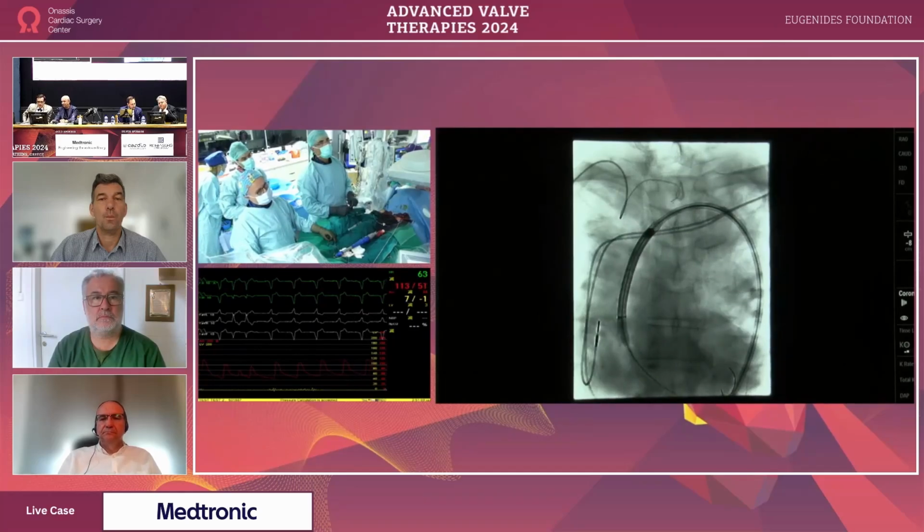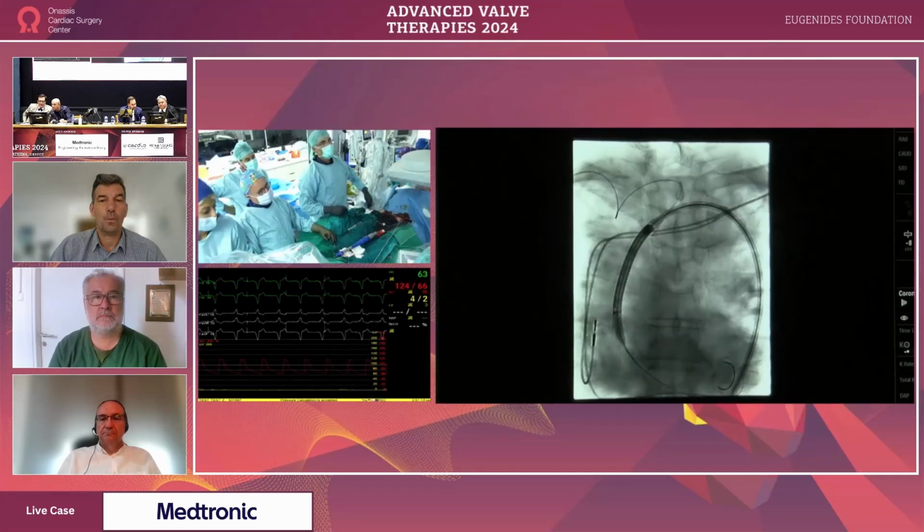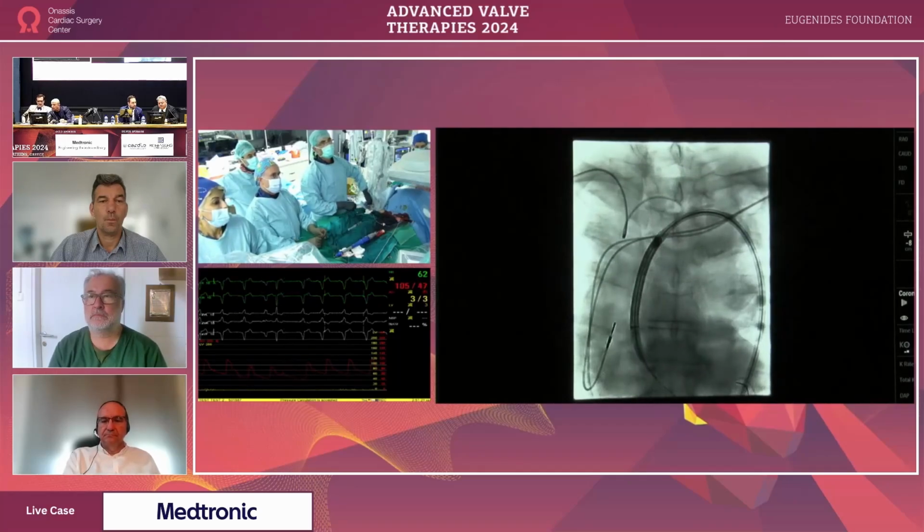So it's not minimalistic anymore, but anyway, it's learnful. Are they happy with their pacing?